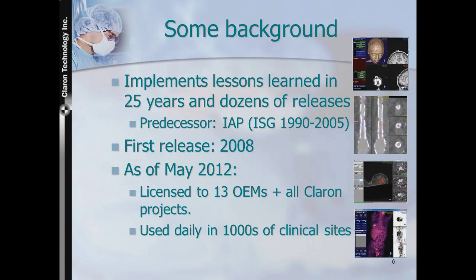Designing a large body of software for efficient reuse is very hard. There is really no substitute for a lot of hands-on experience developing medical imaging applications. At Claron, our engineers not only have such experience, some of it going back to the early 1980s, but some of us were deeply involved in developing a similar framework, the Imaging Applications Platform, or IAP. We learned many valuable lessons from that earlier attempt, and all of these lessons were incorporated into WIF's design.